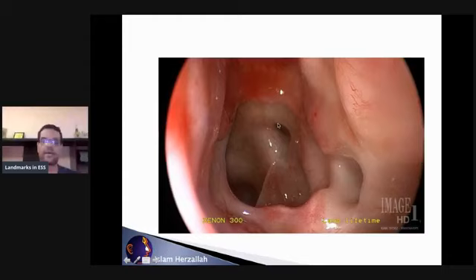That's obviously the area where the anterior wall of the sphenoid was. And this is the area of the bulge for, you know this? Okay, try to think, the cavernous sinus bulge right here. And then that's a retromaxillary area of pneumatization in the posterior ethmoid cells.